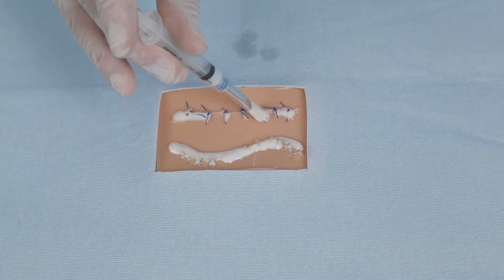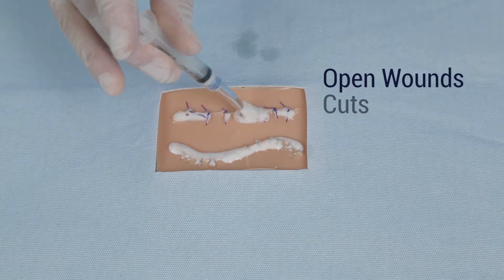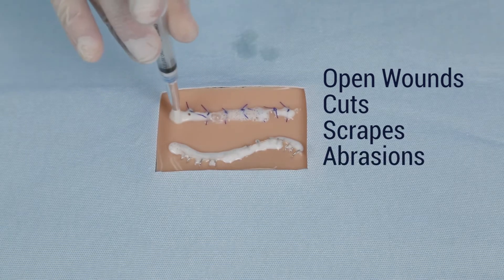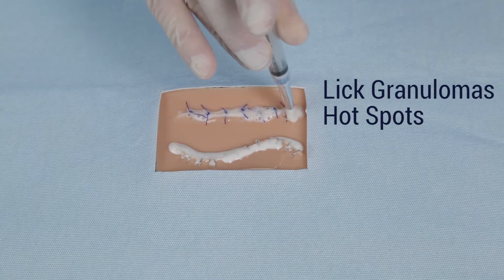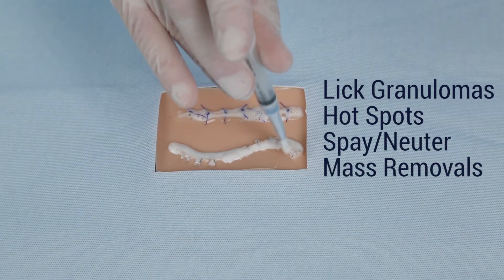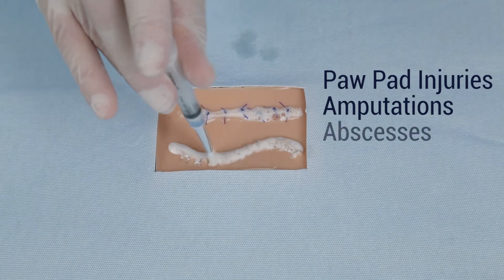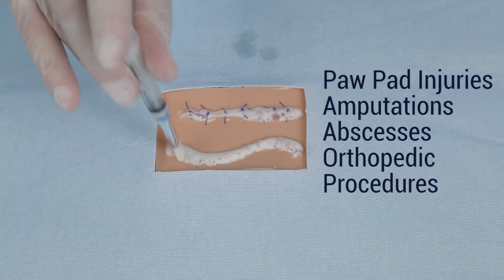Suture Seal is recommended for any open wounds, cuts, scrapes, abrasions, burns, lick granulomas, hot spots, and all surgical incisions including spay-neuter, mass removals, paw pad injuries, amputations, abscesses, and orthopedic procedures.